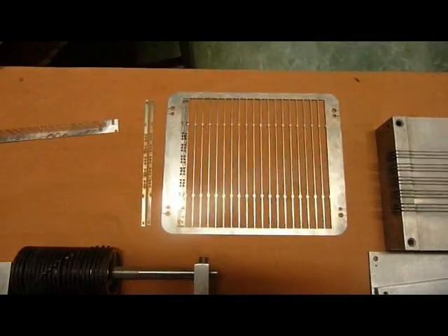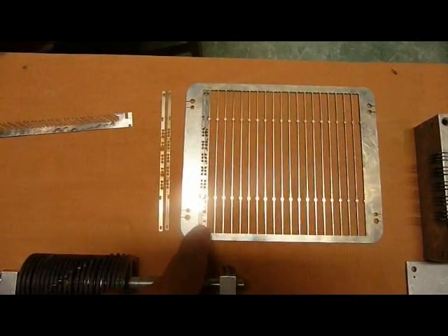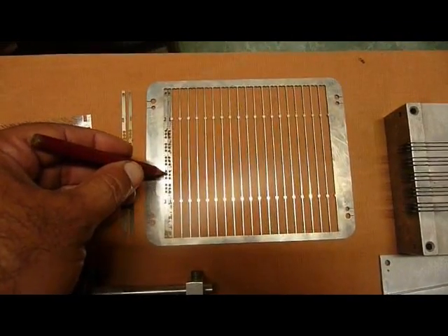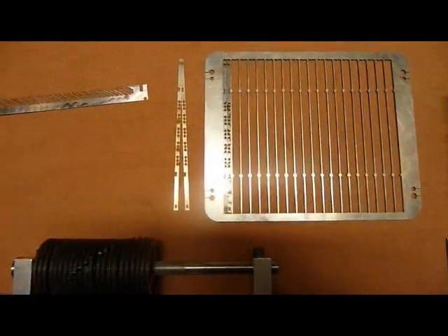This is a picture of the guide and spacer that has the locking slides in between. I've put in two slides over here. You can see they just move a little bit. That's enough to open and close the thing. These are the two slides that are outside over there.